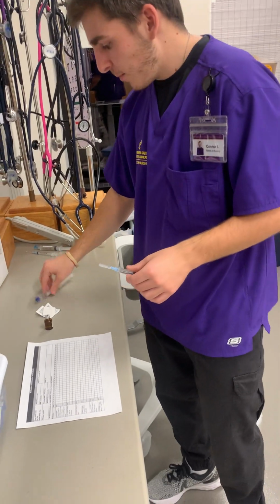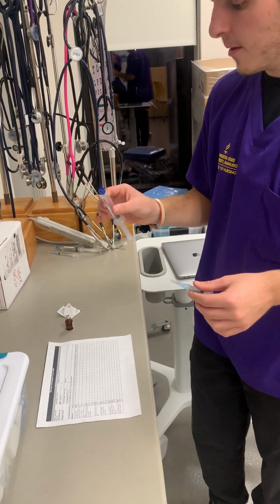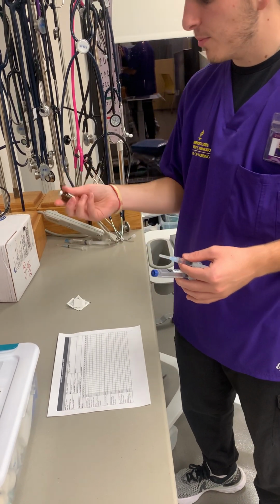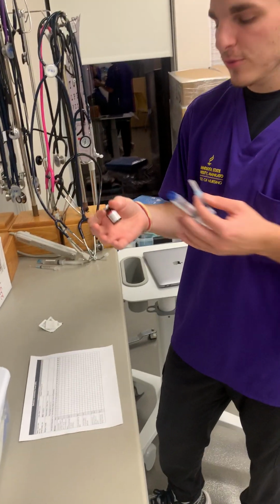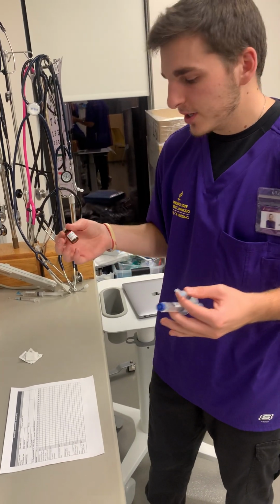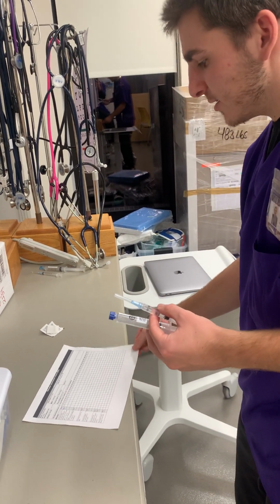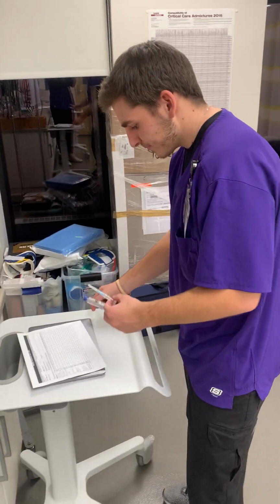Alright, so now I'm also bringing a flush before we give our dexamethasone, as well as I will bring this, and since I did this outside the room, I can bring this and I will label my syringe. So now I'm going to take all this stuff as well as the MAR, and we're going to go into the room.